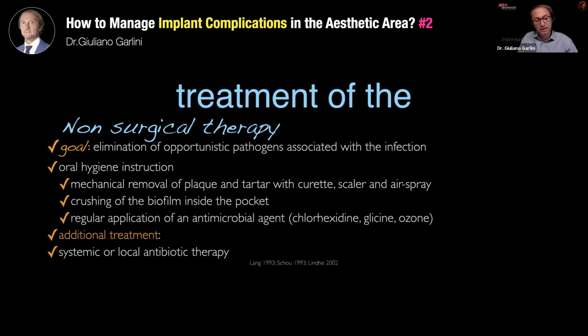The first approach is probably a non-surgical therapy, especially when we are able to see the disease at the very beginning, without a great resorption of bone around the implant. In those cases, we can have a very non-invasive approach with a non-surgical therapy.